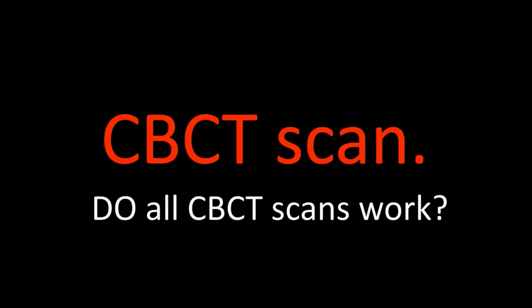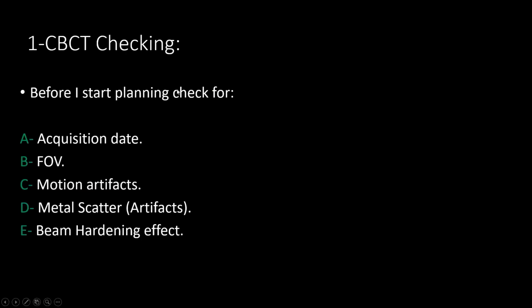What are the criteria of the CBCT scan you're going to be using? And this is what we're going to pay a little bit more attention to. Do all CBCT scans work? And the answer is no.